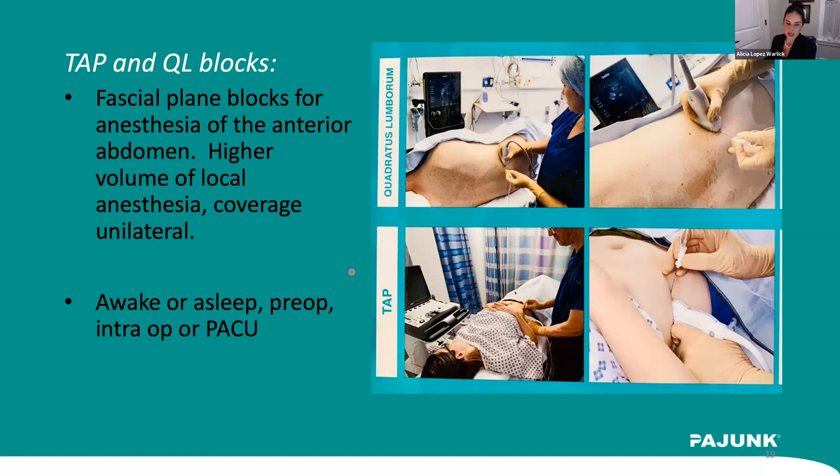If you do these blocks preoperatively, you will probably need to sedate the patient. Patients can tolerate these QL blocks laterally. This person is doing a QL3 block, or a transmuscular QL block, and I'll go over the nomenclature in a couple of slides. And then this person is doing a TAP block laterally, and this patient's awake. But you probably will need some sedation when you go through the skin here. Sometimes patients flinch. So I always like using sedation in the pre-op area.